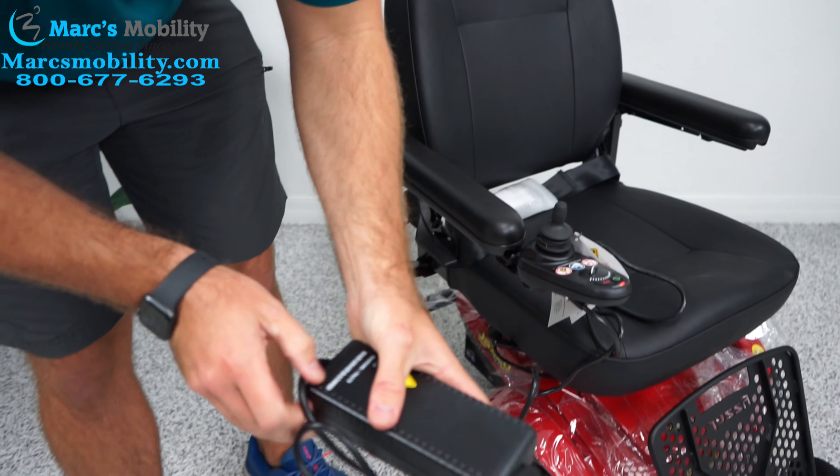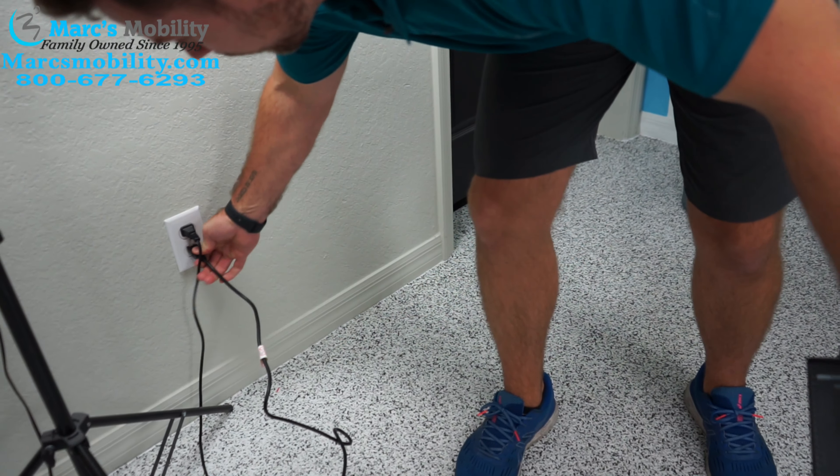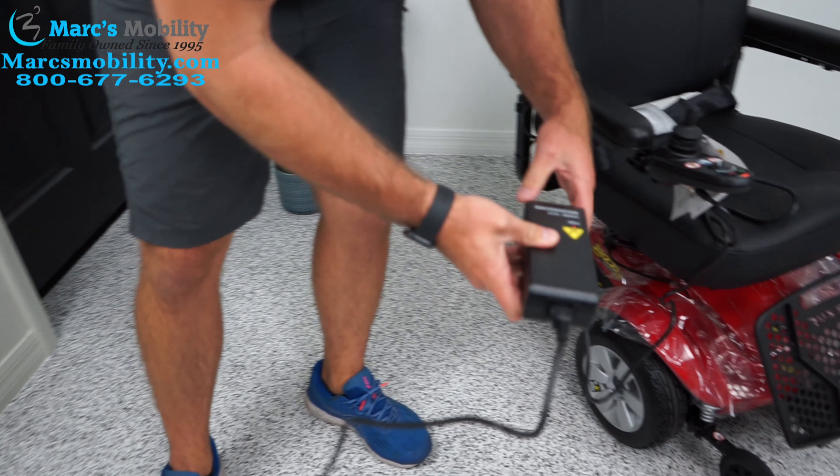In this short video we're going to show you the proper way of charging many power chairs, but especially the Jazzy Select by Pride Mobility.